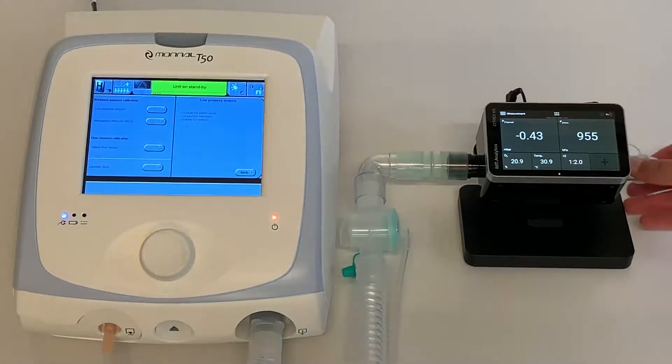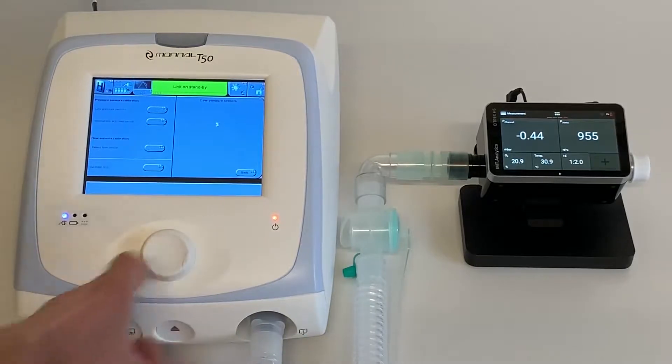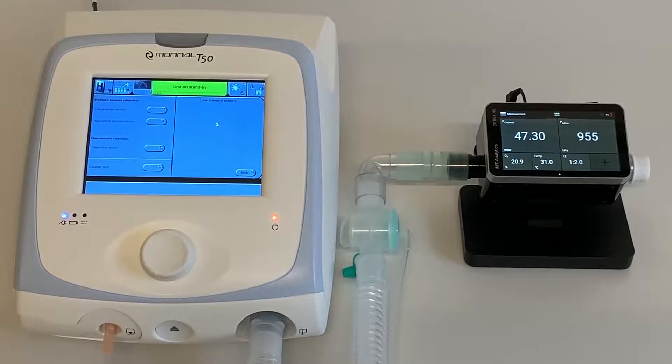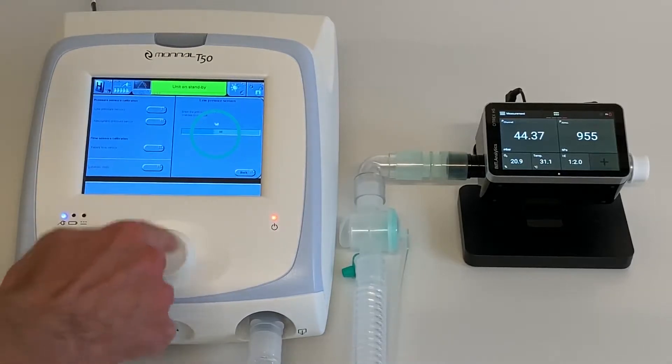Seal the gas outlet of the Citrex and press the control knob to confirm. Wait until the pressure stabilizes. When the value on the Citrex H5 is stable, you can set the value on the Monal T50 ventilator. In our case, 44.3 on the Citrex, so we select 44 on the Monal T50 by turning the control knob to the correct value. Press the control knob to save the setting.